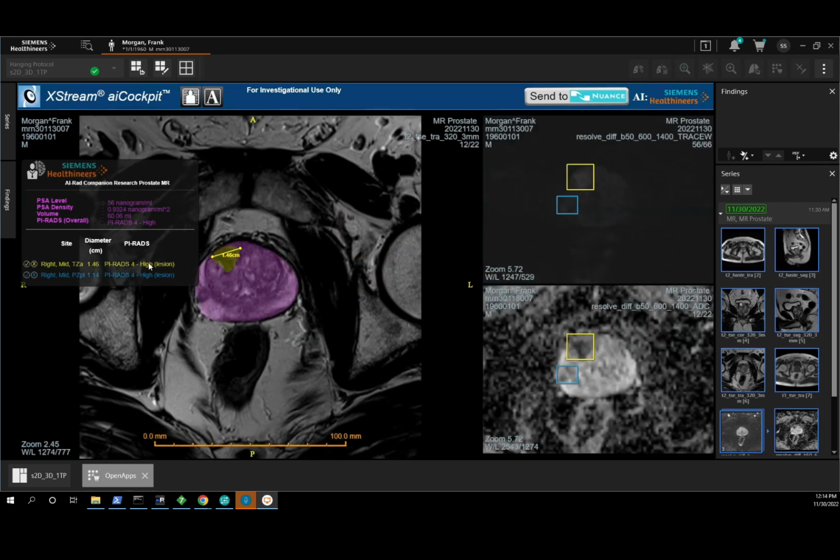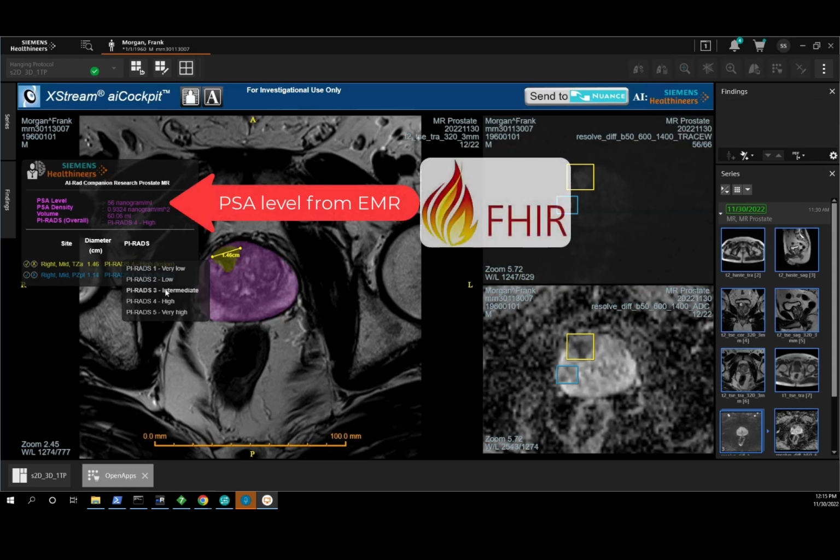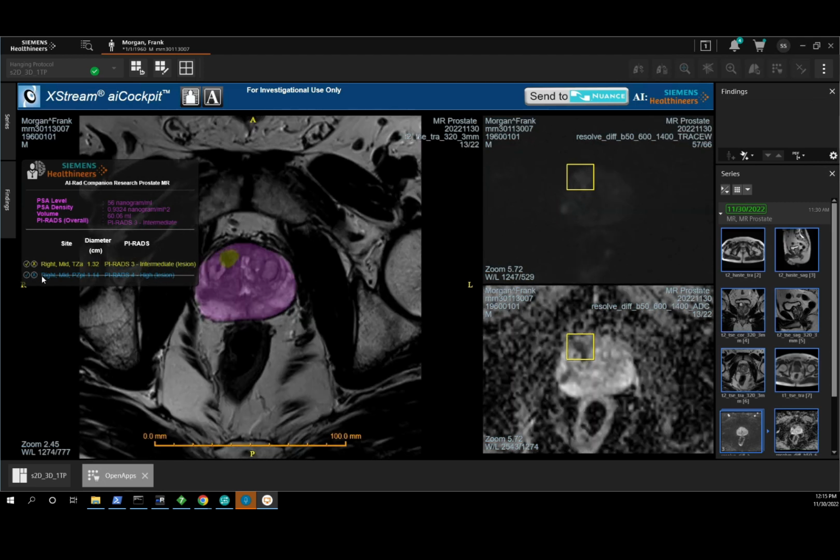The radiologist is able to view all the AI model's findings in Fovia's AI Cockpit viewer. This includes prostate gland results and lesion-specific information. Note that the PSA values that were seen in the EMR by the clinical team were obtained by a FHIR request initiated by Qvera and then integrated with DICOM data, specifically volume measurement, allowing for calculation of PSA density, which requires the PSA level. The radiologist is able to now edit and exclude any of these data points before they are transmitted to the reporting system to be pre-populated in the report.